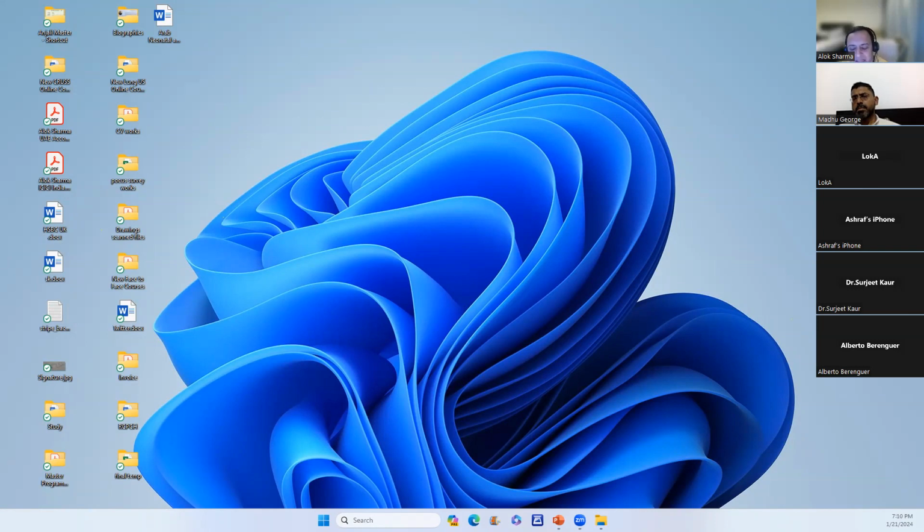Maybe that's a case that I would keep for the longer peer reviews. It would be nice to see all the segments, and that's where I would do a comprehensive scan. So for a baby that's supine, consolidation tends to localize to the PLAPS region, can be posterior because of how exudate goes. That's where you'd need a comprehensive scan. And in that situation, if you wanted to show us a comprehensive scan, I have no objections.